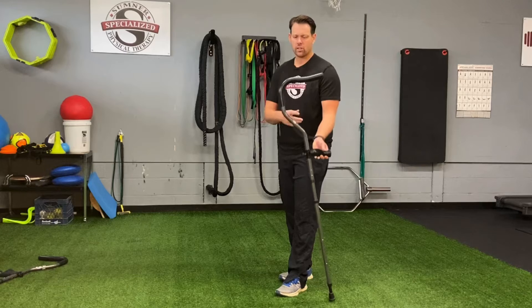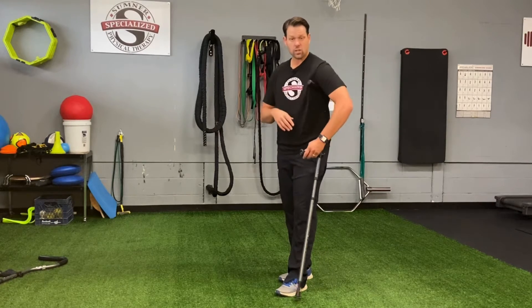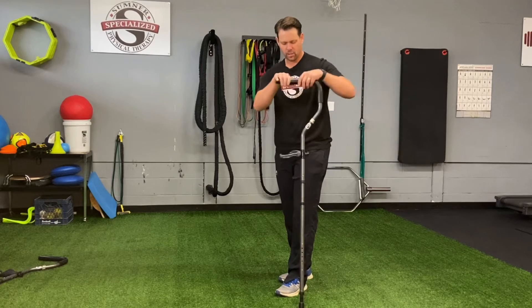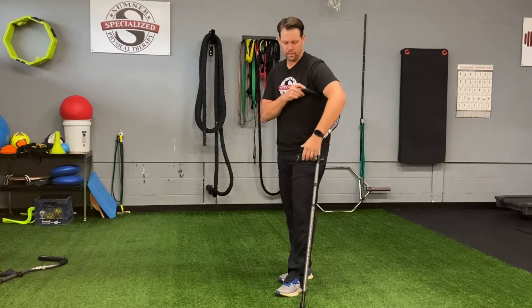This is a unique crutch that you'll see with a lot of sporting events. It goes this way into the body and has a nice ergonomic handle for the hand as well, and it has a little spring on the end of it. So these are kind of nice for an athlete, but not for everyone.